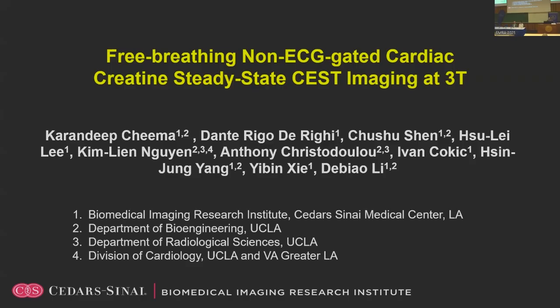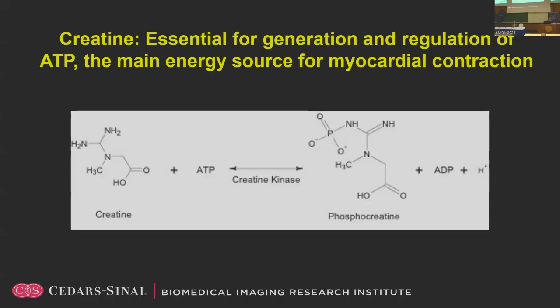So we made a first attempt on this, and many others have done this as well in the past, including Dr. Jay Zheng, who is here from WashU in St. Louis. CEST imaging, as you all know, is very challenging. It requires a long scan time because it requires many offset frequency images. So we made some technical improvements to make this happen.